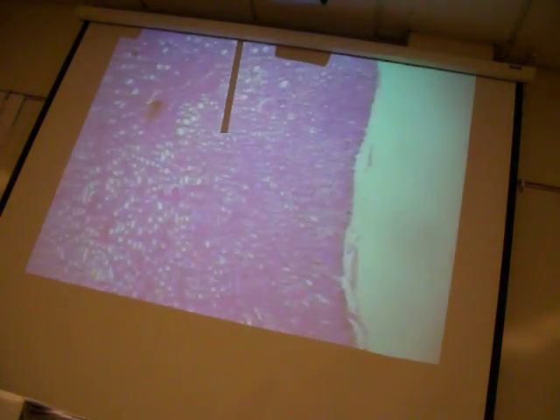Now, the next tissue type that we're going to take a look at is simple cuboidal epithelial. So on a lab practical, when I ask you to name this tissue type, you have to write it all. You can't just write cuboidal. You have to write simple cuboidal epithelial or epithelium. So if you've got big bubble writing, write smaller. Okay? You may have to write it in 2 lines.